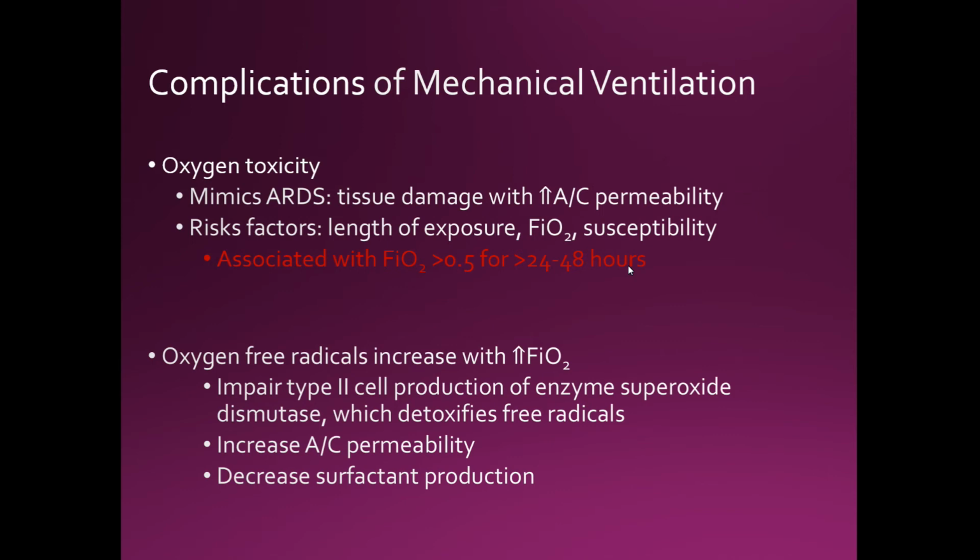On their final rounds at 4 a.m., they're going to go back and switch the patient back. Now, on patients who are on mechanical ventilation, what they do is give a treatment and leave the small volume nebulizer running. What is that doing? That's giving them more pressure.